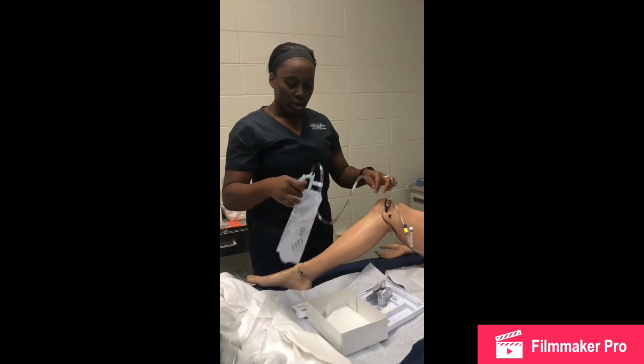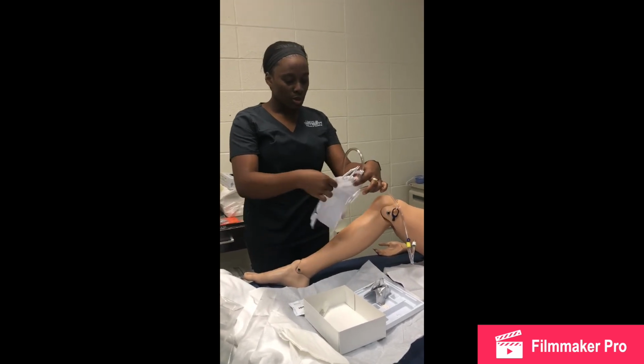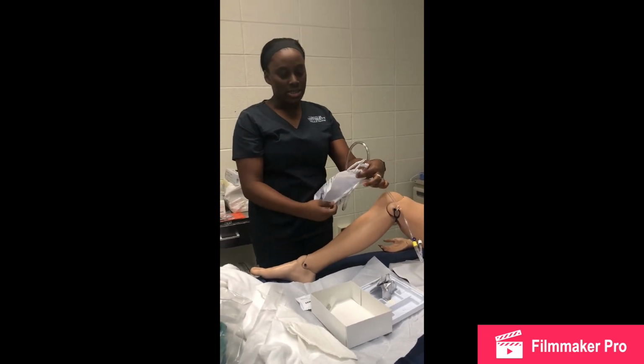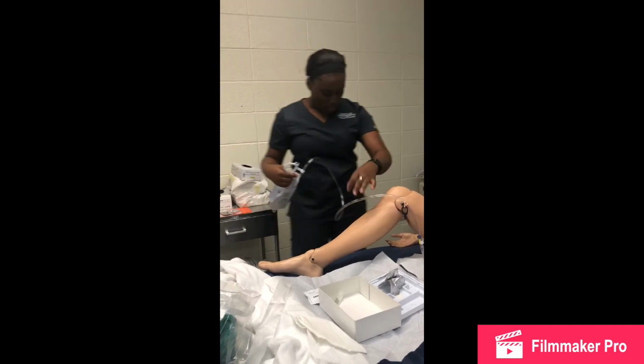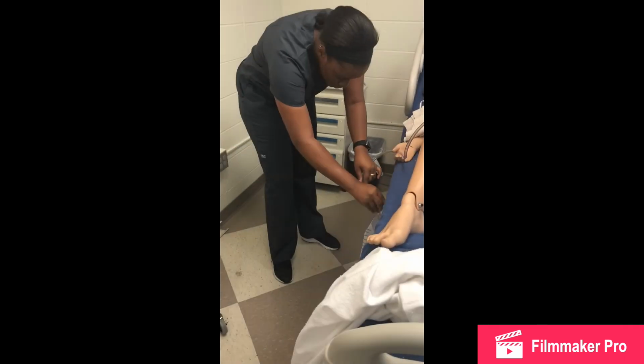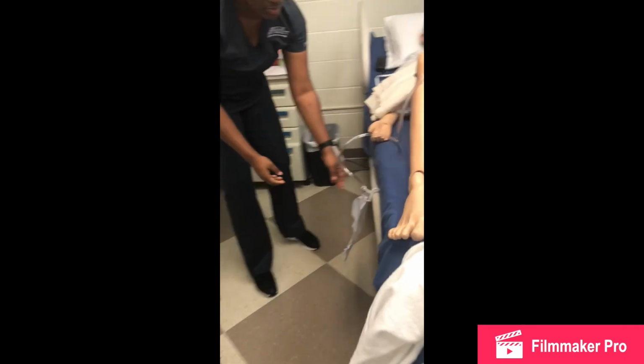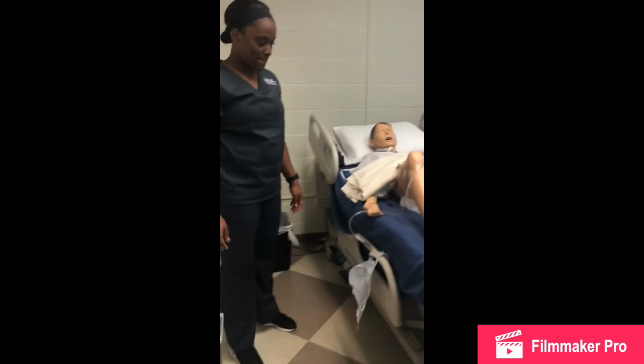Then I would record the amount of urine that came in, the date and the time, the color, right? Or if it has any odor, and I will put it on the side of the bed right here. So that's it for my insertion of a Foley catheter.